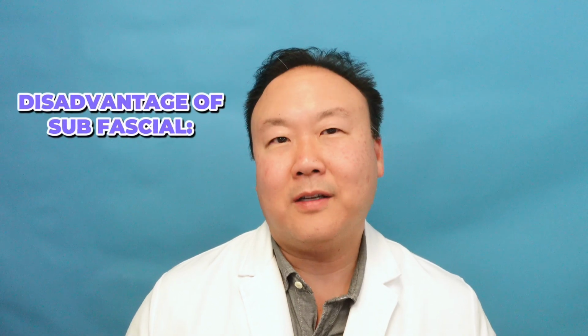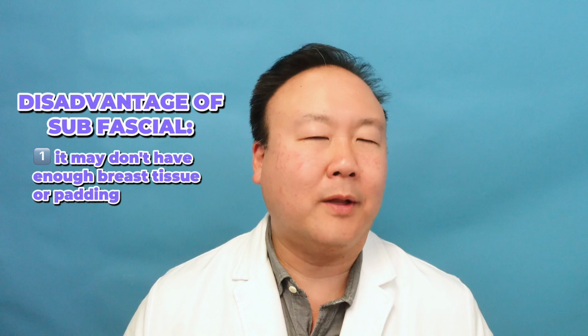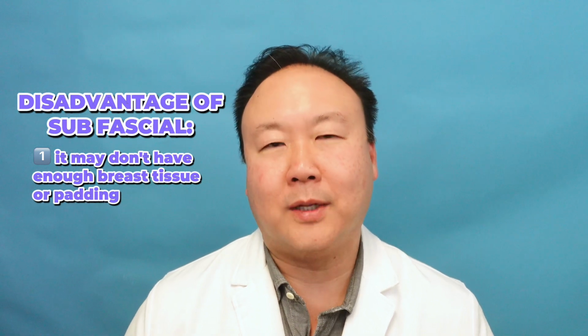So there is a big disadvantage with the subfascial approach. One problem is that sometimes there may not be enough breast tissue or really padding over the actual breast implant. That is a concern. That's similar to what we have with a true, pure, above muscle placement, subglandular.